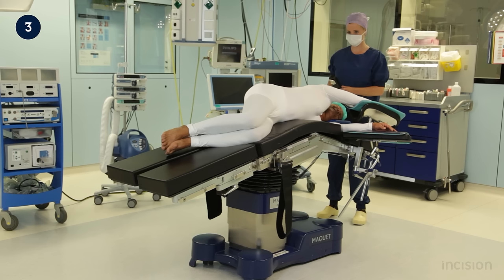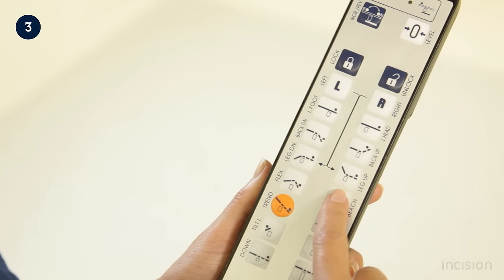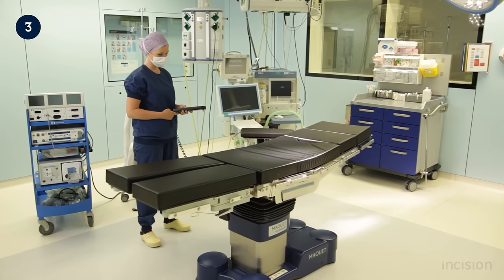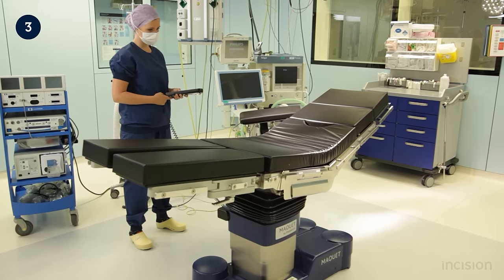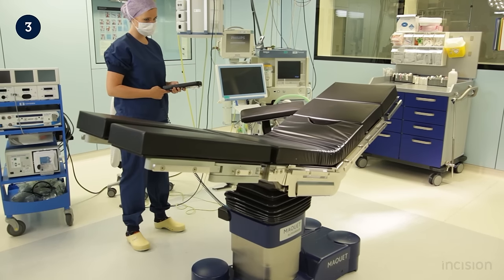Another table position that uses the single push function is the Fowler's or beach chair position. Holding the button down results in movements of multiple parts of the table. For this reason, the movements are shown without the patient model on the table. Take note of the slow, controlled, alternating movements designed to flex the patient's hips and position them in an upright, seated position.